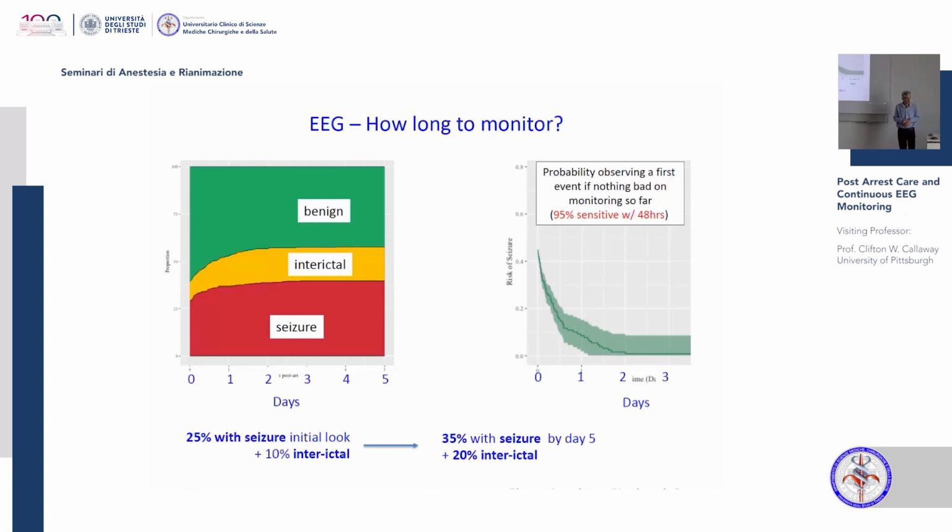But the continuous EEG has become our standard practice for the cardiac arrest patients for the first 48 hours. We decide about the next 24 hours at that point, but we monitor essentially everyone for the first 48 hours. We will stop if they wake up. So if they wake up and ask what all the wires are, it's not necessary because I have a good clinical exam.